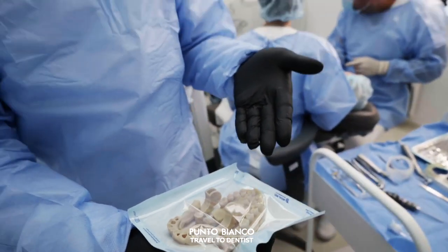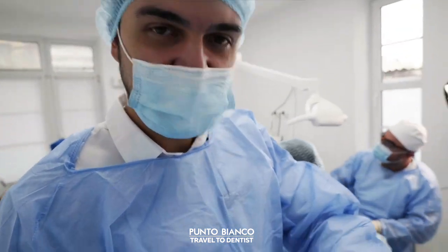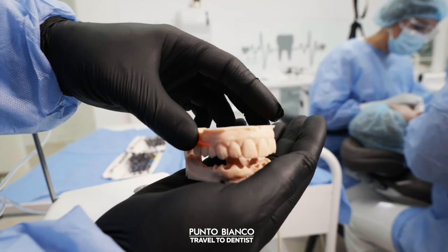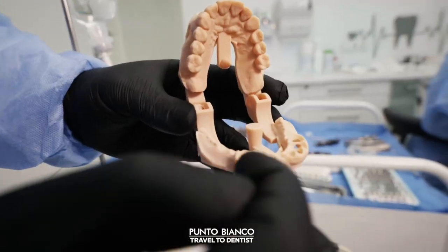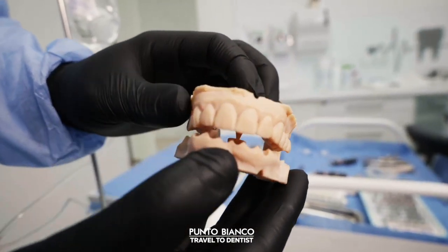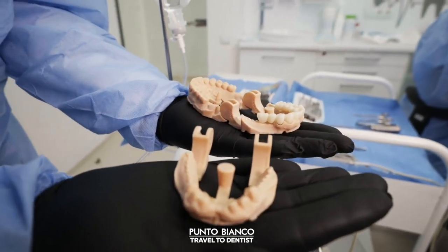We also possess the models of the patient's upper and lower teeth. They are as sterile as we can make the materials that will be inserted into the mouth. These are the articulated models of the patient's arches. This will be the situation post-tooth extraction and will continue until the insertion of the remaining 4 implants in place of the extracted teeth. In my hand, I have 2 models of the same patient.